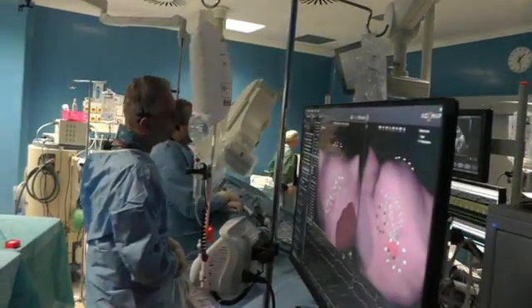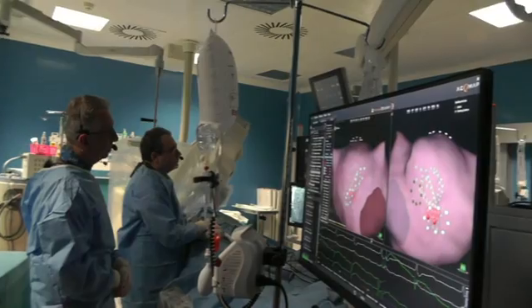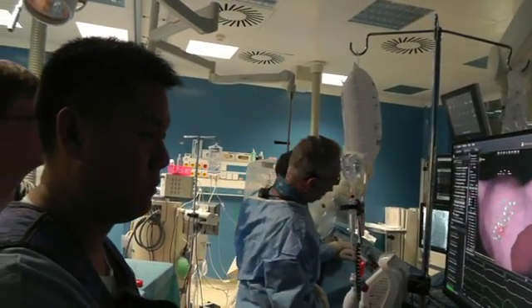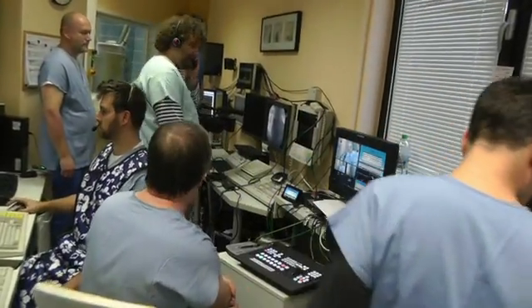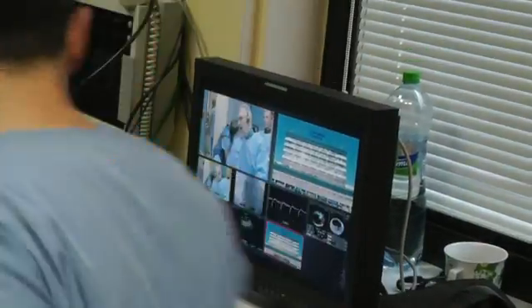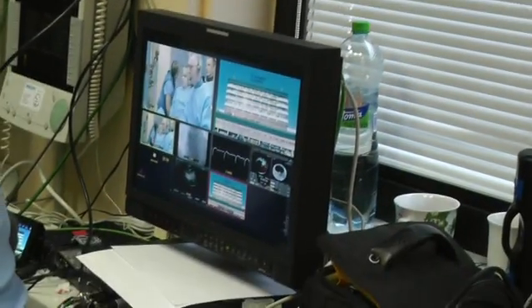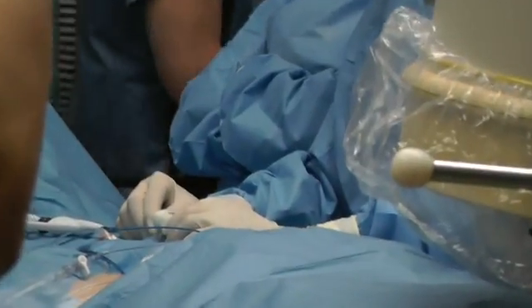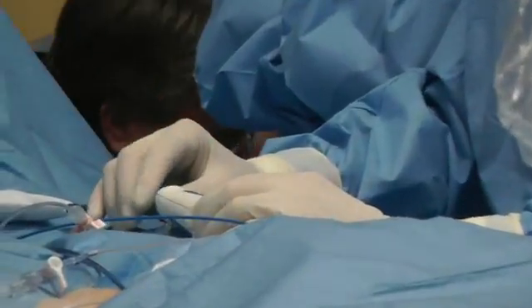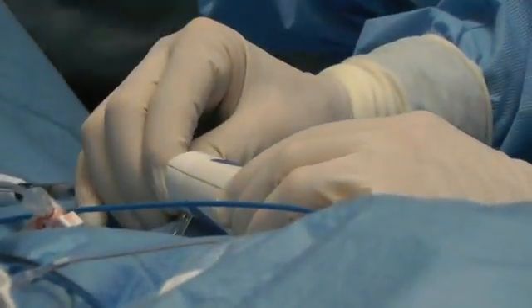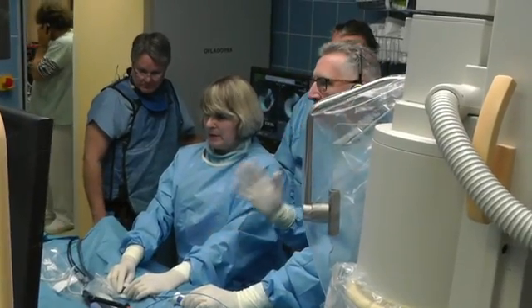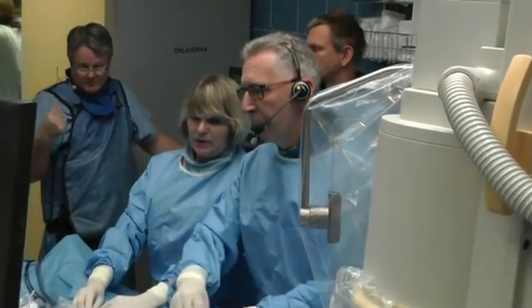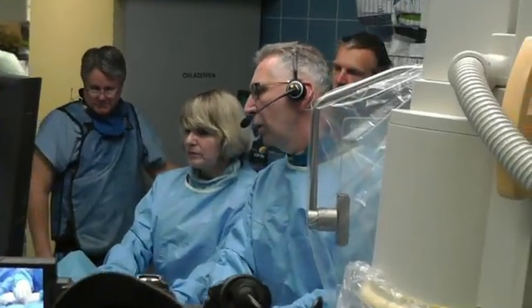We're going to leave now and come back. The next center we will go to is the Manzino Hospital in Milan. Okay, now we are just — look, you can appreciate it really better. Posterior wall — let's check. Even when we are like one centimeter away, you can still heat — okay, and actually under.